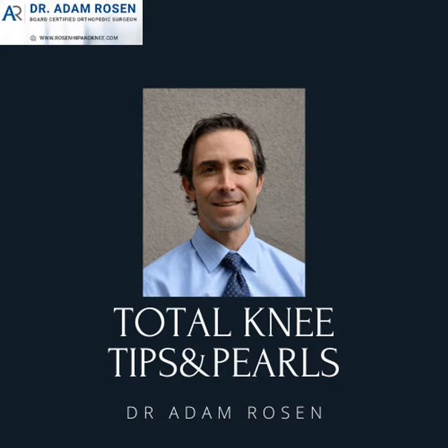And then at this point, the next thing I do is very similar to my regular type of exposure for a primary. I'll stick my finger in, let's say this is for a right knee. I'll get my finger just over the patellar tendon above the tibial tubercle and kind of pull it back towards me with my left hand. And then I'll release a little of the tissue off of the anterior tibia. I find this helps me expose the medial side before I do my medial release, and it also takes some of the tension off the extensor mechanism.